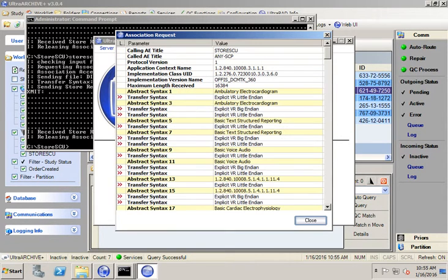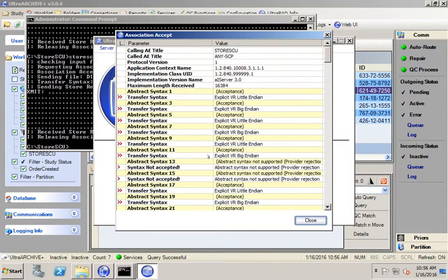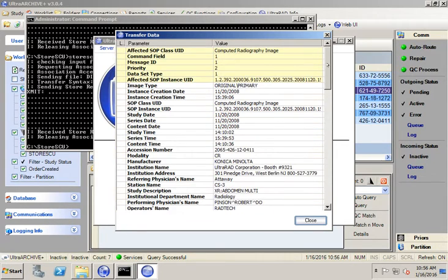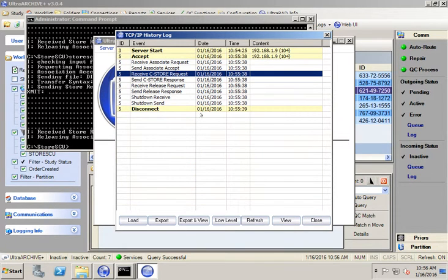So we can see here the association request from Store SCU. It called UltraARCHIVE Plus any-SCP, so I can see the IP address, the AE title that they were calling themselves and calling us. I can see what they were requesting. So this is a list of the transfer and abstract syntaxes that they requested in the association. This is what we accepted. And then finally, you can see the actual DICOM information that was sent, including the pixel data.